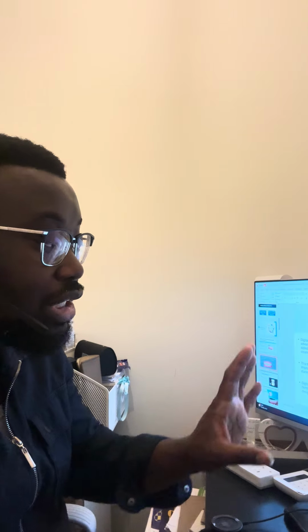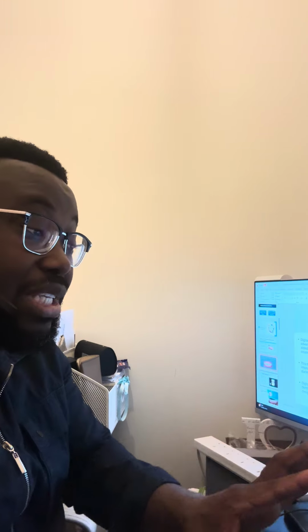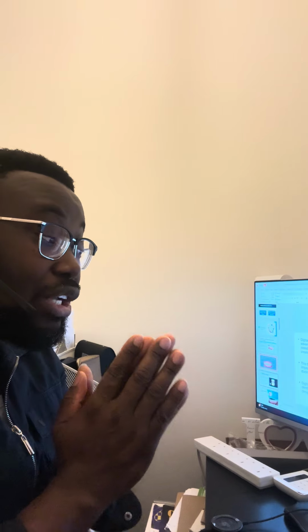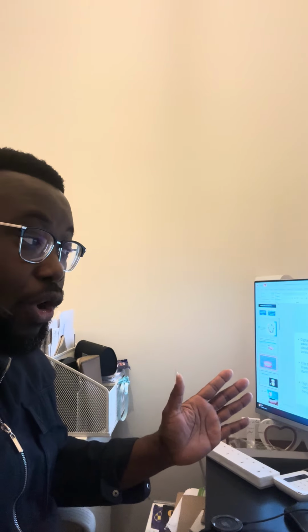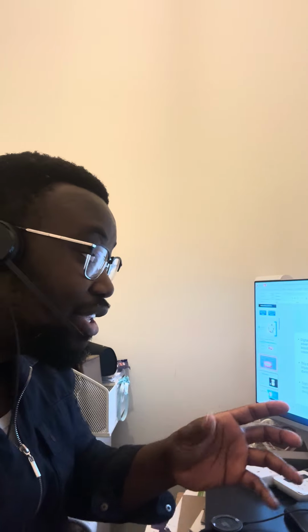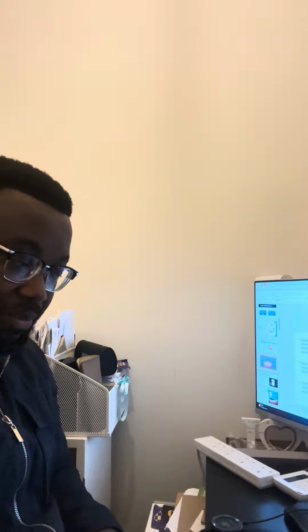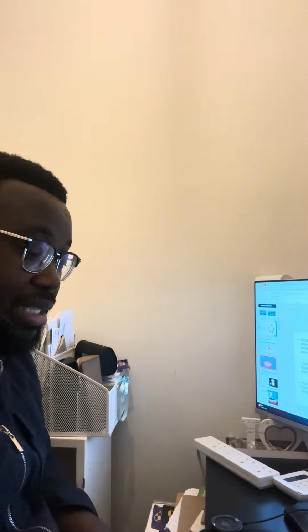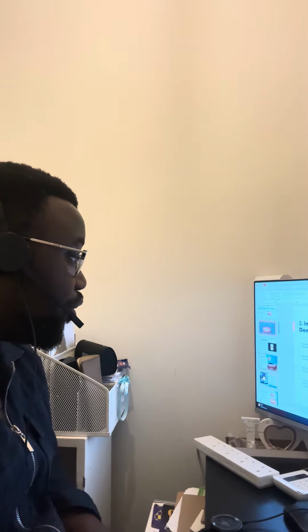So the digital denture incorporation of the CAD/CAM system in your denture production workflow will eliminate all those problems completely, because you are able to store that into the patient's file, and if the patient needs it again, you just send it to the printer and the printer produces that same denture for you with a high level of precision and accuracy, exactly as it was before with the first one.